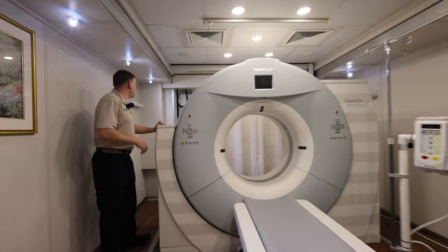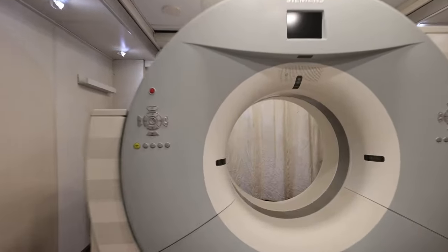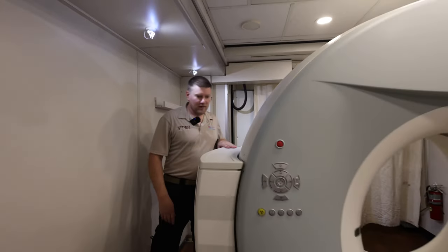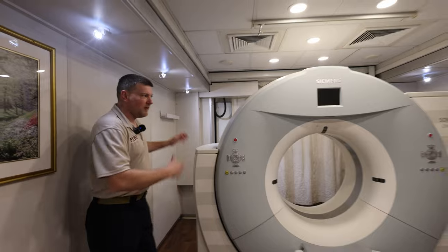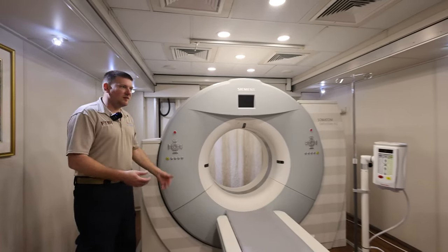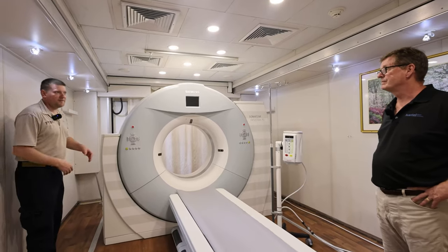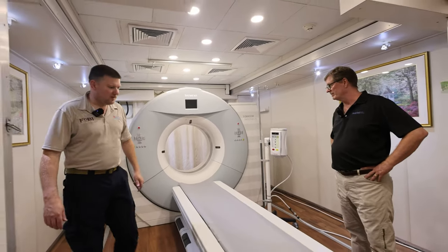And there's a lot of space back behind it, too. That's where the equipment room is. Wow, there's a lot of space in there. That's your master shutoffs and the stuff. Well, this is even very serviceable, because this is our second newest trailer. You've got a lot of space to pull covers off and whatnot. Yeah, it's cool. Absolutely.